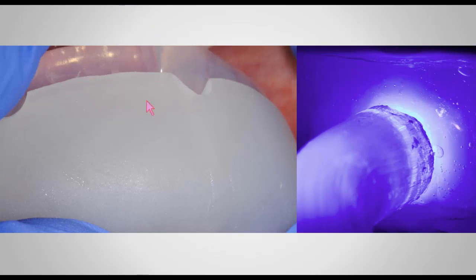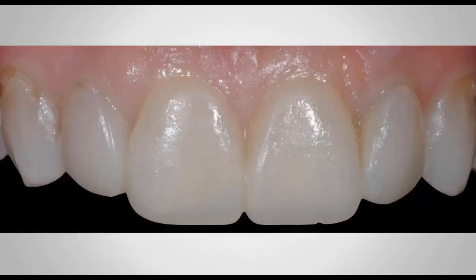Then I go back, I inject the flowable composite into the intaglio surface of my clear PVS. With the clear triad shell on the outside, I sit this directly into the patient's mouth. Now you can understand this clear triad is not going to let me alter the shape of this clear PVS whatsoever. And then I start light curing through the clear triad, 20 seconds per tooth. Here there are going to be 4 teeth. So that's the time that I'm going to spend light curing.